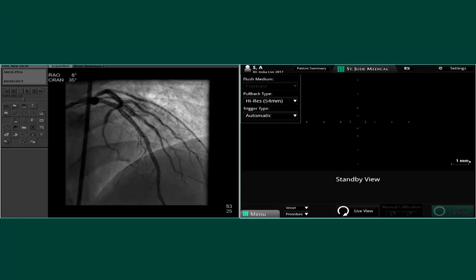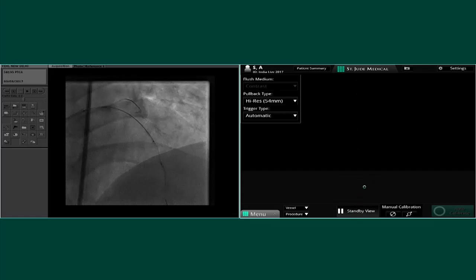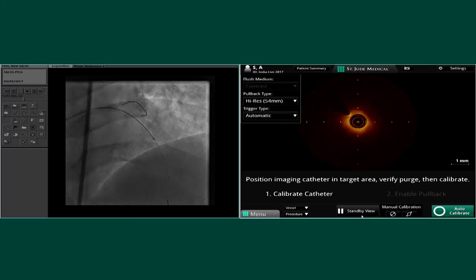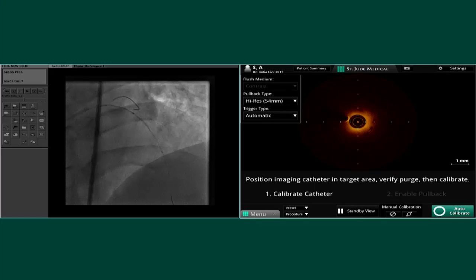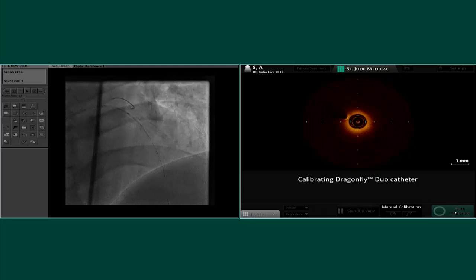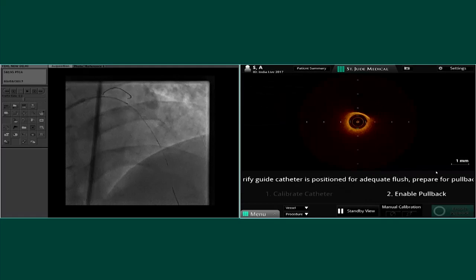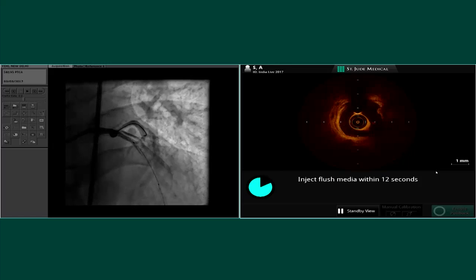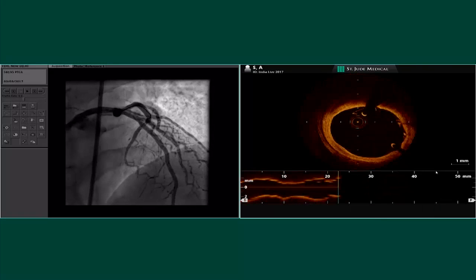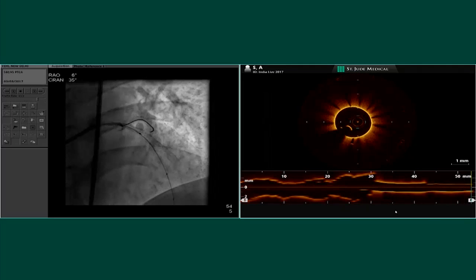I'll come back. Just watch this, because I think this is going to be so important. I'm going to bring this back a bit. Make a short run and start a little bit closer to the left main. Yeah, short run, absolutely. Let me know. Yeah, well, we've seen it. Okay, this one is good.